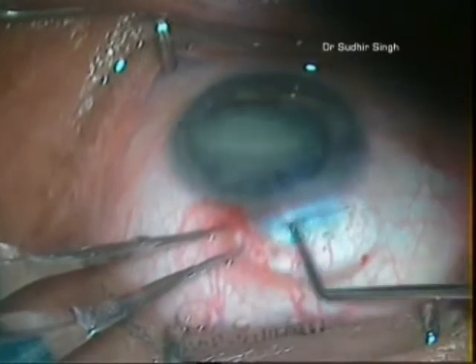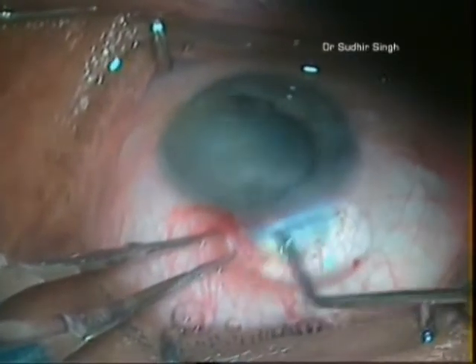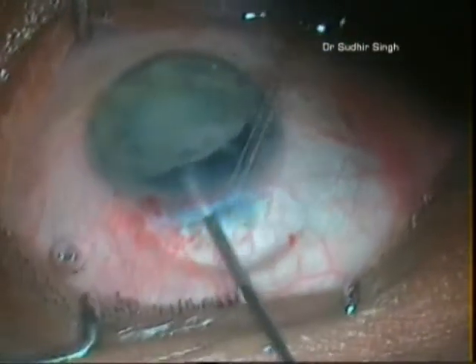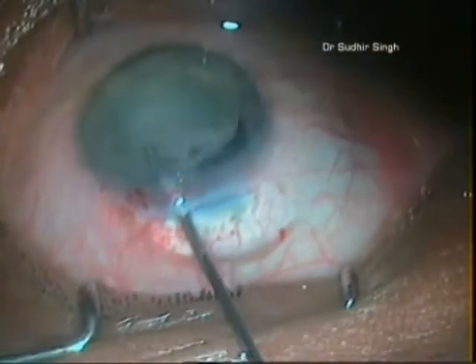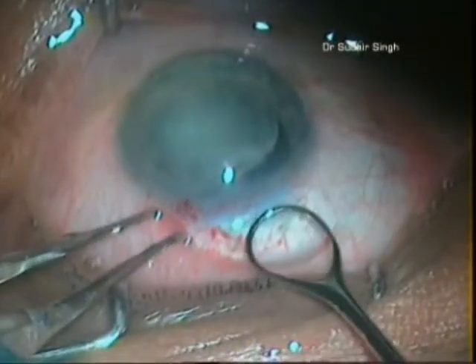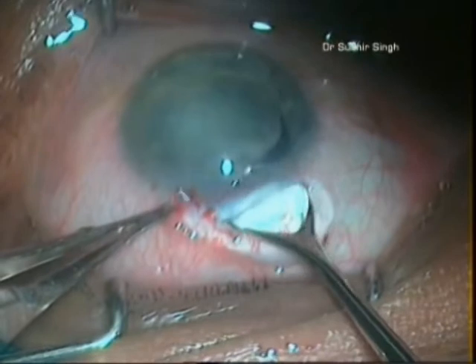Enough viscoelastic is placed between the cornea and the superior surface of the nucleus, and between the inferior surface of the nucleus and iris. The globe is stabilized with tooth forceps and a vectis is introduced through the tunnel and positioned between the iris and the nucleus.